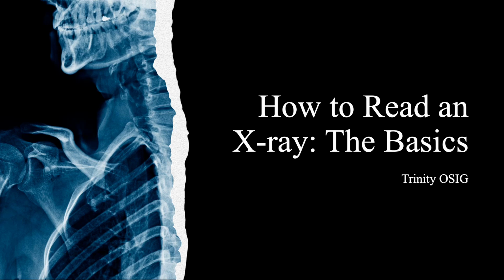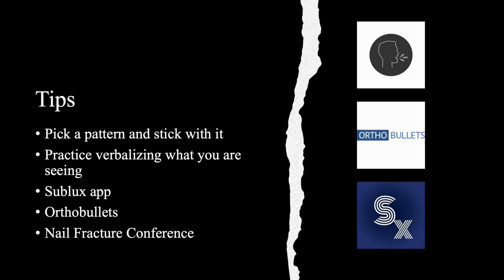Hi everyone, this is how to read an X-ray, the basics. So this is just a very brief overview on some tips and tricks on how to read and then present an X-ray. So just some tips to start off with.